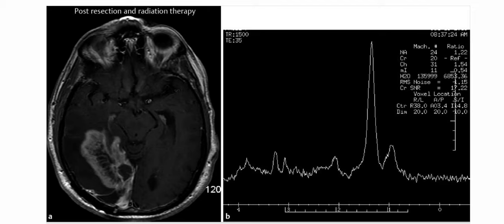This is a 70-year-old man who has presented with high-grade glioma post-excision and radiation therapy. The axial T1 post-contrast MRI shows mass-like enhancement within a surgical cavity in the right occipitotemporal region with surrounding hypointense vasogenic edema. Short-echo MR spectroscopy over the region of enhancement reveals suppression of metabolites with a prominent lipid peak at 0.9 ppm and prominent lipid-lactate peaks. Considering these imaging findings, the top differential should be radiation necrosis. Recurrent or residual tumor and post-treatment changes can also be included.